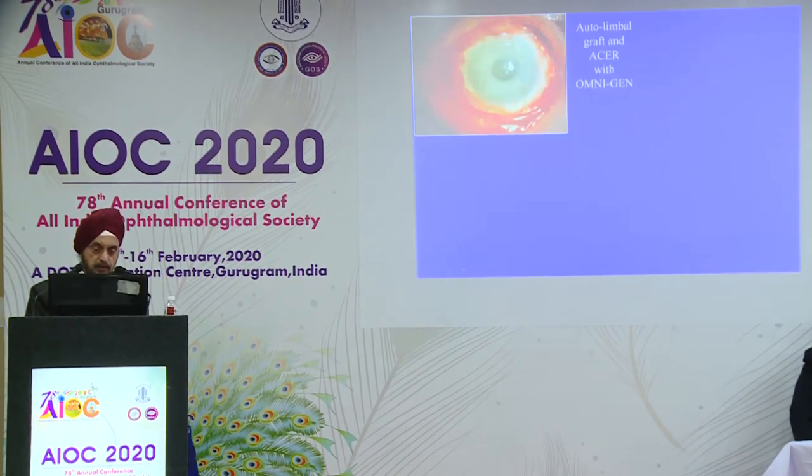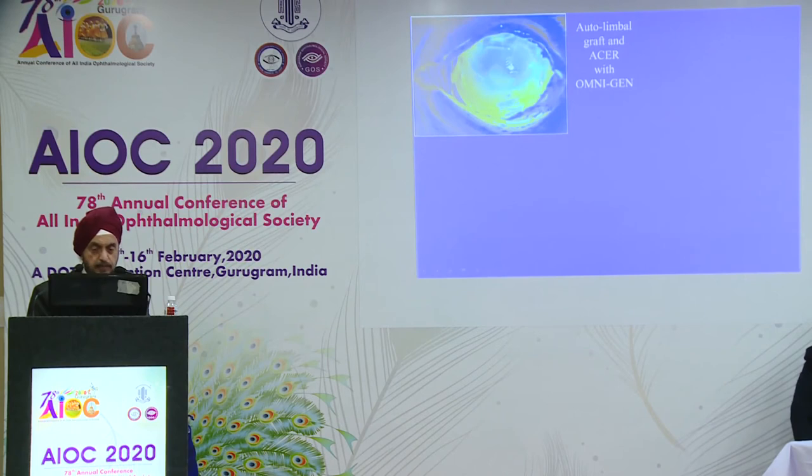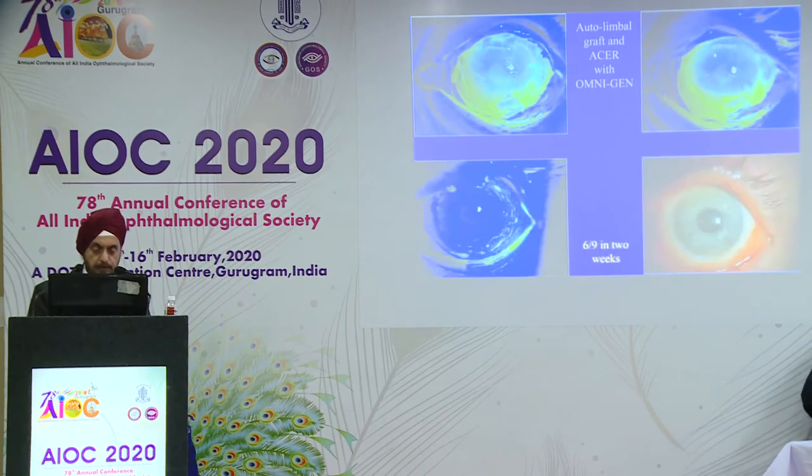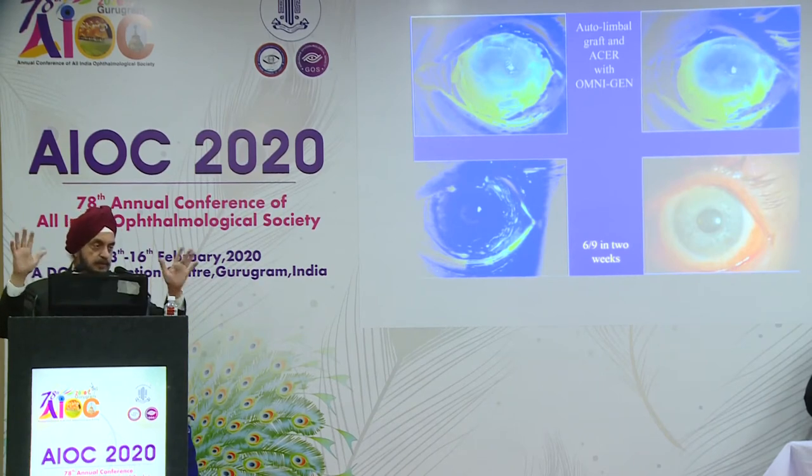So those are the explants, and the outer membrane was the dried membrane. You can see it's staining with fluorescein, but you can see through it. And you can see the epithelial cells are growing from the explant, this sheet here and this sheet over here. So you can see right through this dried membrane. And when you take it off, see how nice and clean the cornea is, because the cornea is only covered by corneal epithelium. You can put this membrane, send the patient home, come back after 1 or 2 weeks, and you'll find there's no chance of admixture of corneal and conjunctival epithelium.